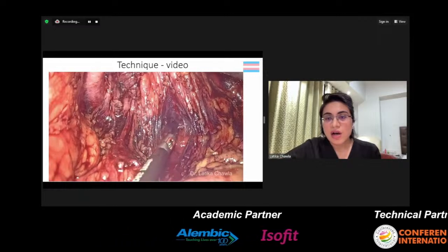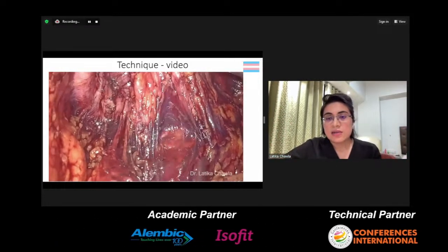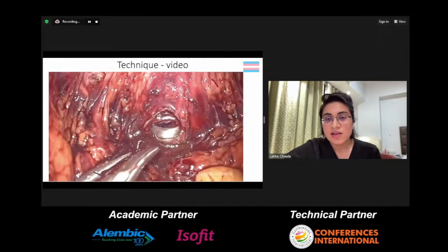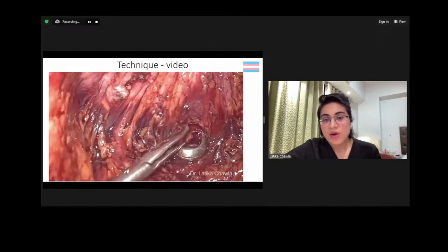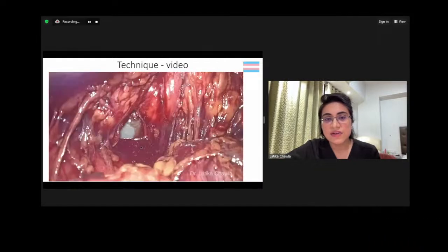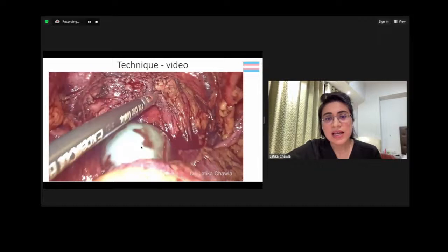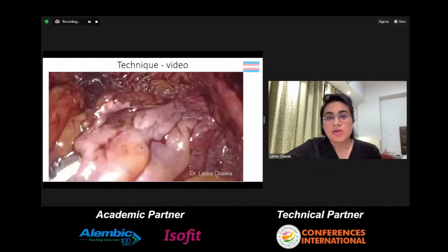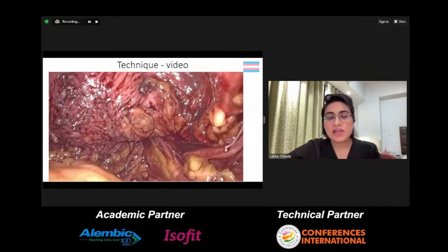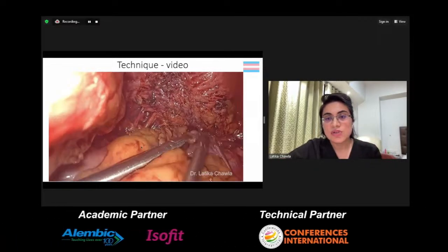Now, once we come lower down, we are going to remain only central because, like I said, the ureter enters from both sides. The plastic surgery team in our case was the one doing the dissection from below and created the tunnel from where we create the neovagina. Now, once the peritoneum is entered, we do blunt dissection to extend the entry, and a silicone dilator is inserted from below, and this is how it looks. Now, usually we will take the two ends of the flap that we've created and feed it through the neovagina to the outside.